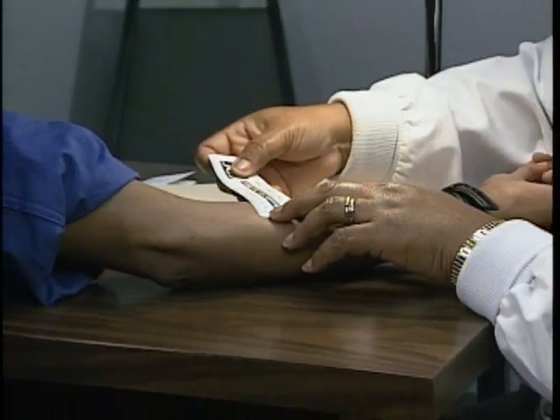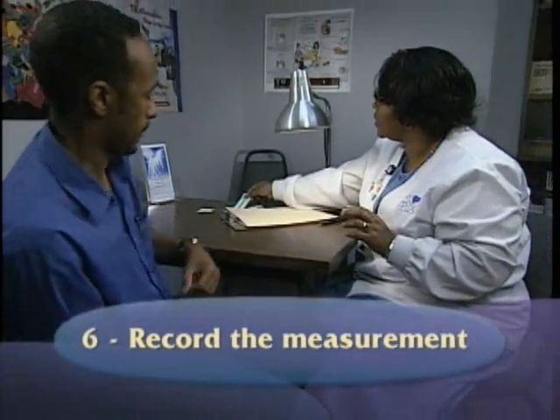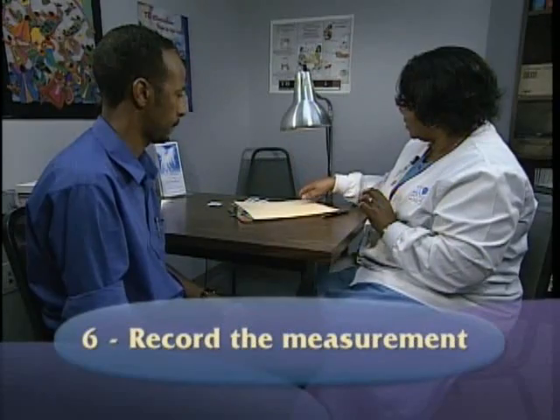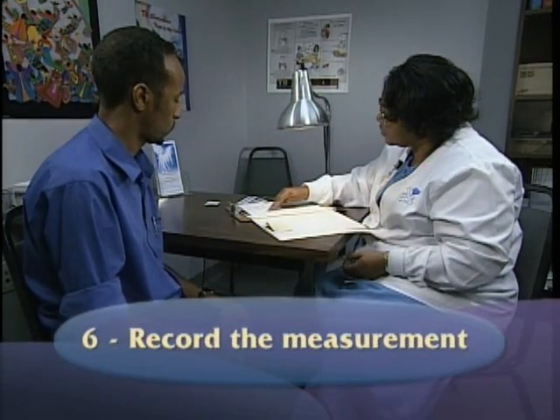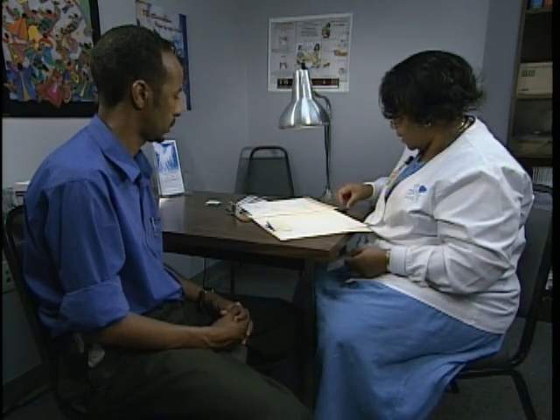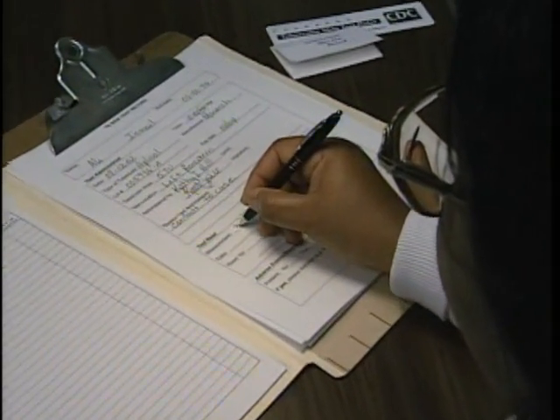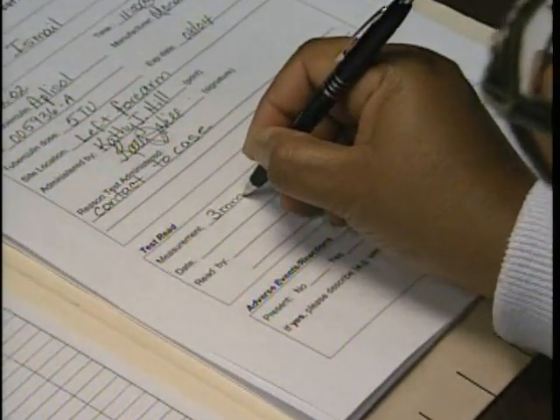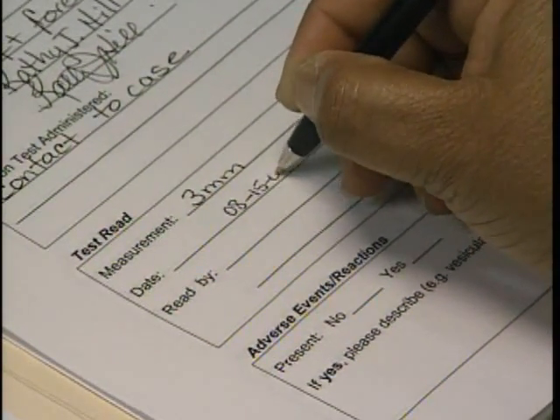Immediately after the test is measured, write the exact measurement in millimeters of induration on the patient's record. Do not simply record the interpretation of the results as negative or positive, and do not record the results in centimeters. For example, an induration that measures 3 millimeters should be recorded as 3 millimeters and not as negative.